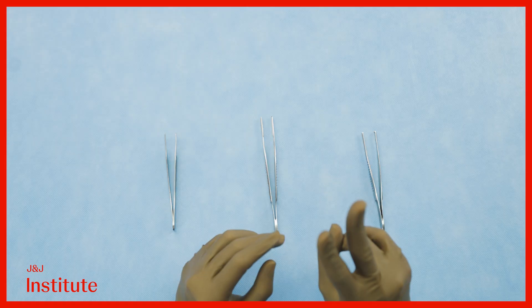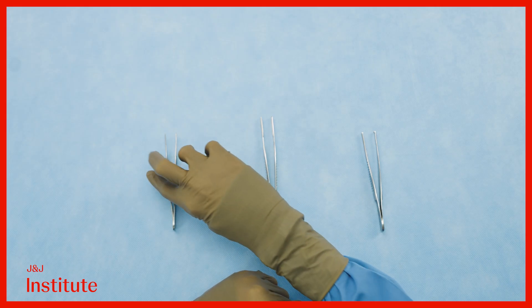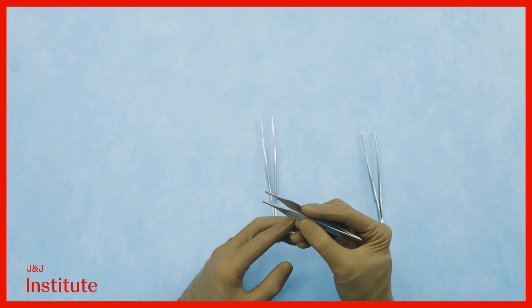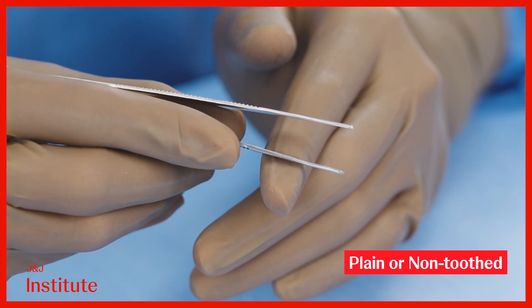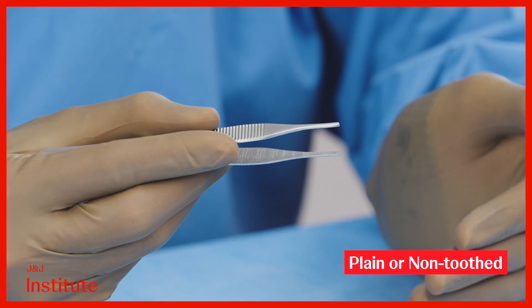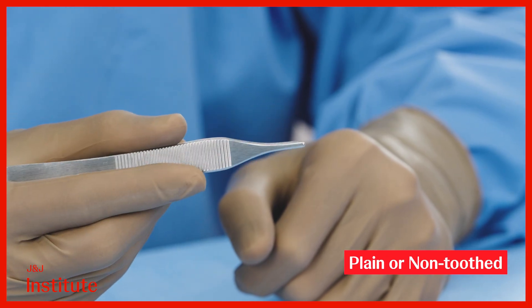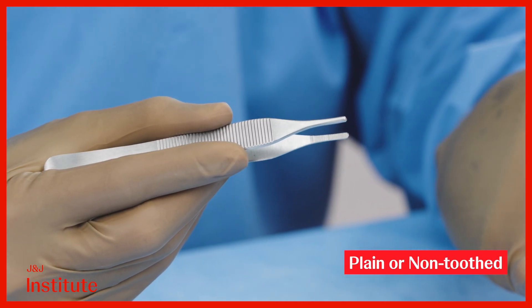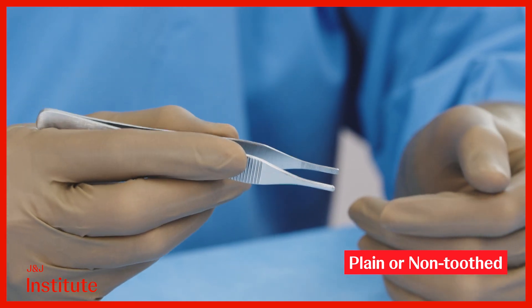Moving on to forceps, there are two primary types: toothed and non-toothed. Plain or non-toothed forceps typically feature transverse milling and offer a less secure grip, making them less effective at holding needles securely. Ironically, non-toothed forceps can be more traumatic as they often require more force to grip tissues, increasing the risk of injury.